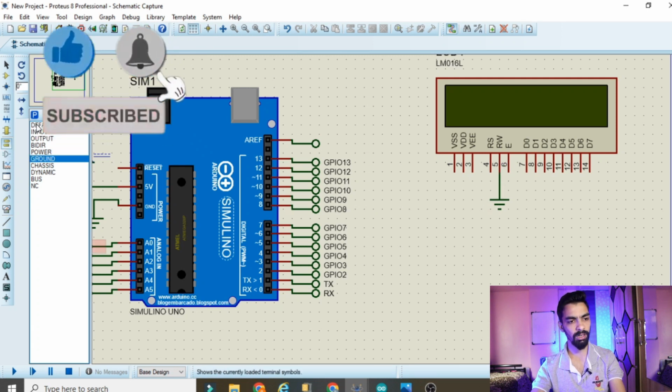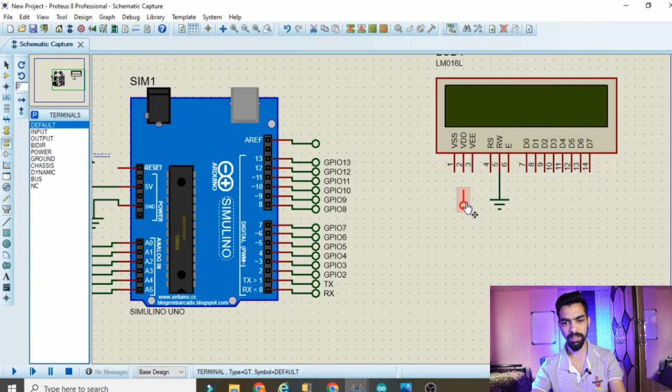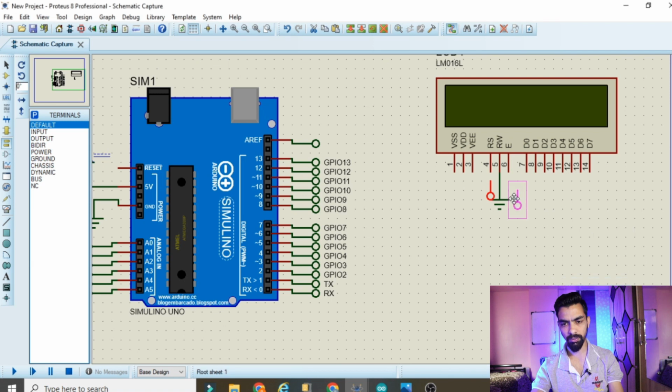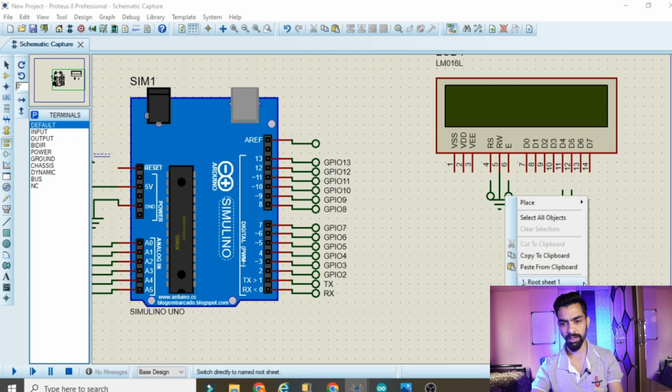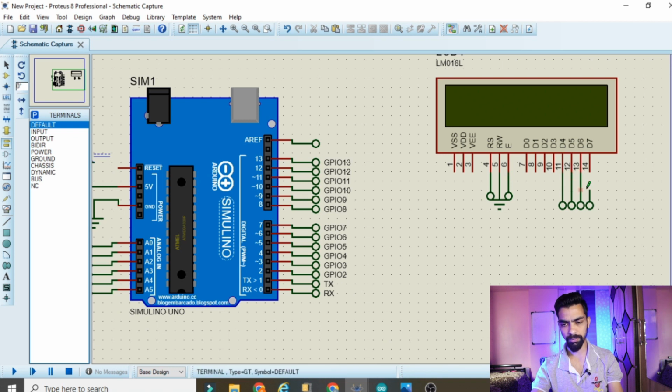So go to terminal mode, then click on default. Take one default pin, right click, rotate anti-clockwise, place that default pin in front of RS. Copy that default pin, right click, copy to clipboard and paste in front of enable. Same, right click, paste in front of D4, right click, paste in front of D5, right click, paste in front of D6, right click, paste in front of D7. Then connect the default pin one by one here.